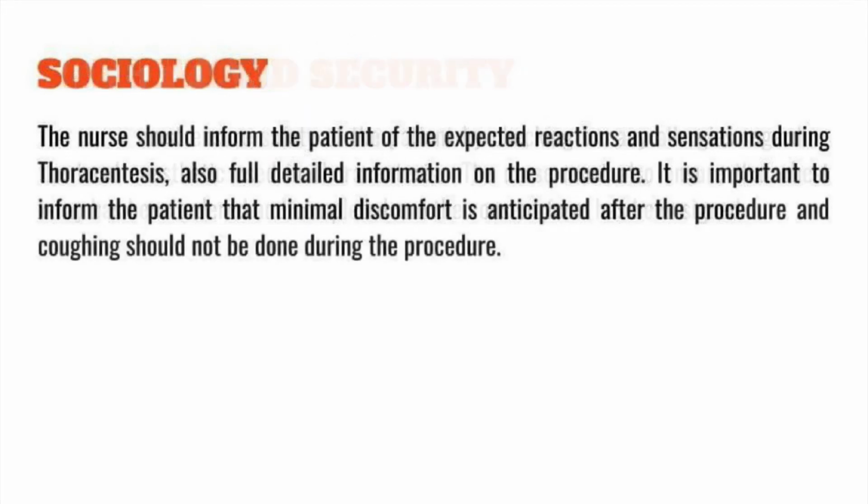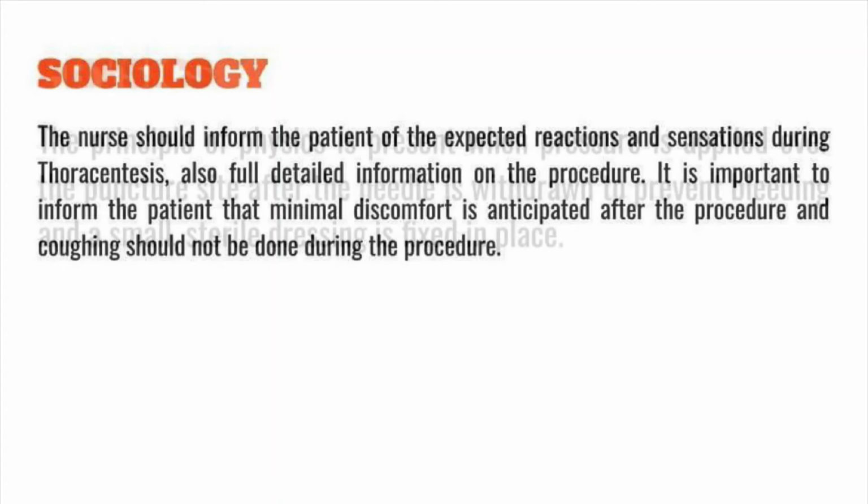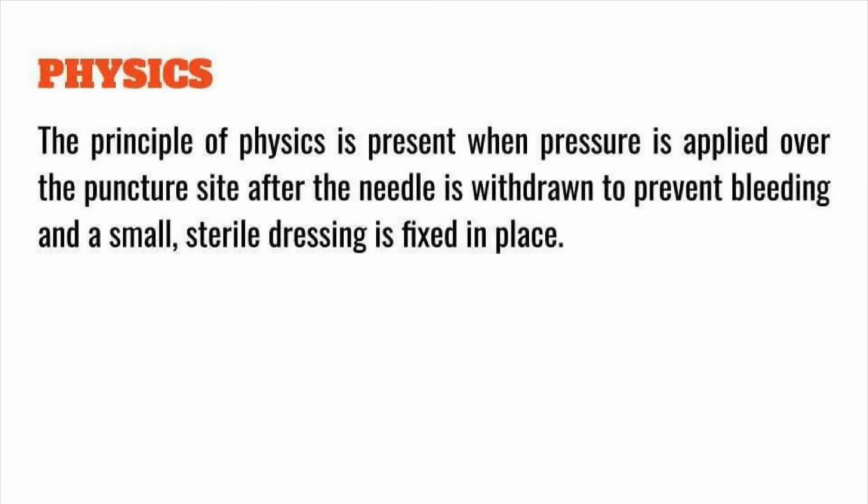Next, we have the principle of sociology. The nurse should inform the patient of the expected reactions and sensations during thoracentesis, and also give full detailed information on the procedure. It is important to inform the patient that minimal discomfort is anticipated after the procedure, and coughing should be avoided during the procedure. Lastly, we have the principle of physics.